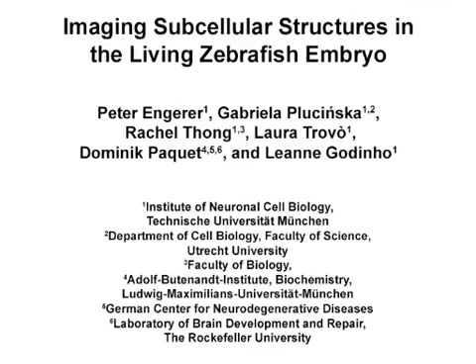The overall goal of this imaging method is to study subcellular organelles in a vertebrate in vivo. This method can help to answer key questions in the field of neuronal cell biology, such as dynamics of mitochondria or centrosomes in an in vivo context.